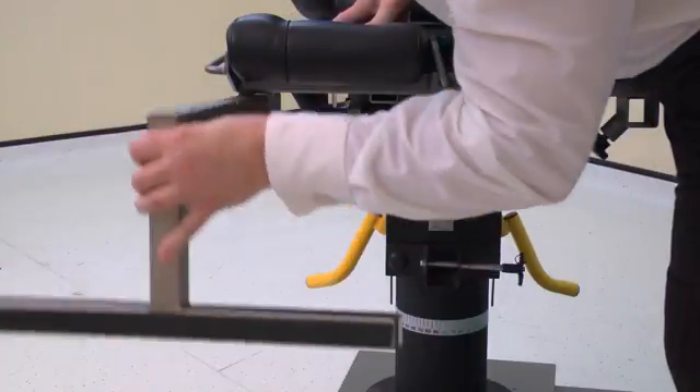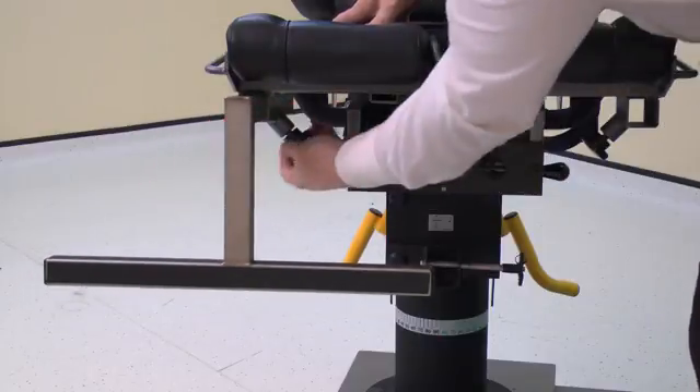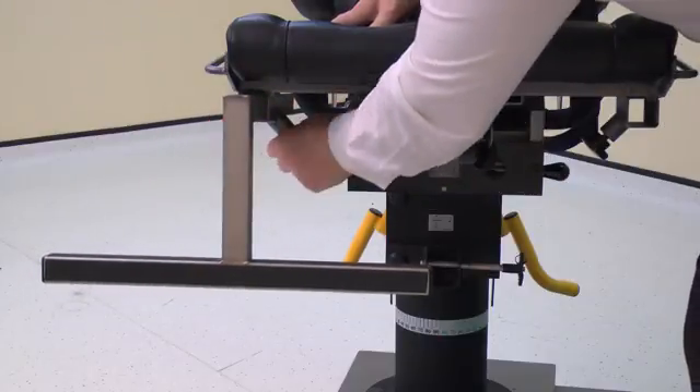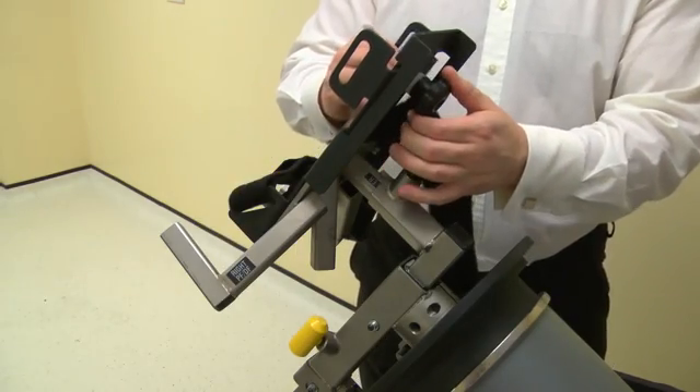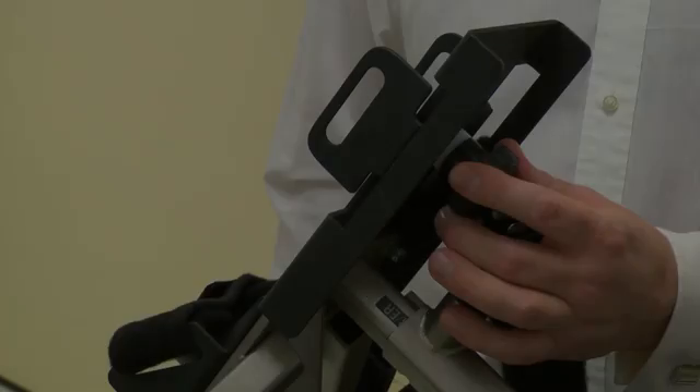Top tip: this stabilizer may need to face up, not down, depending on the height of the subject. Before applying the foot to the footplate, first make sure the straps are undone and the plate is fully loosened.